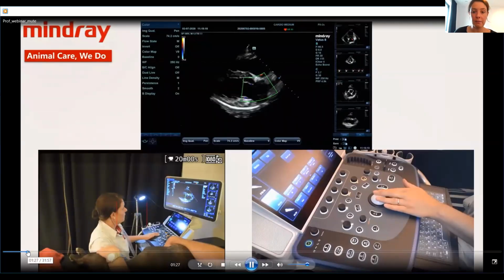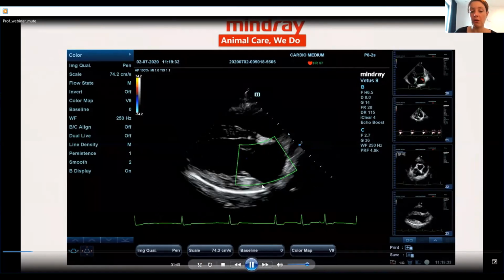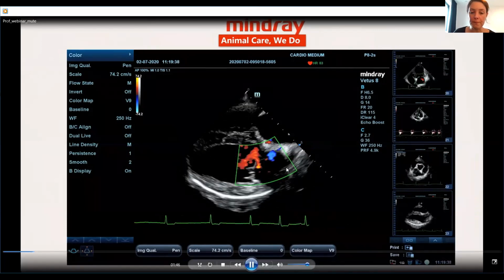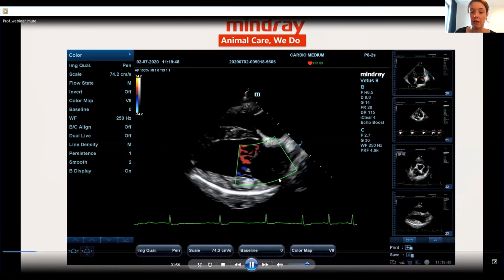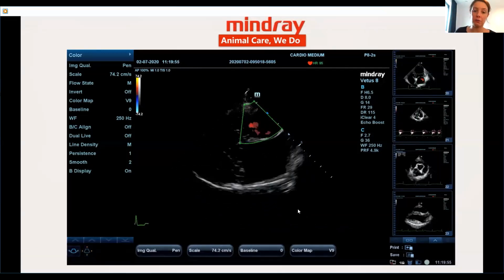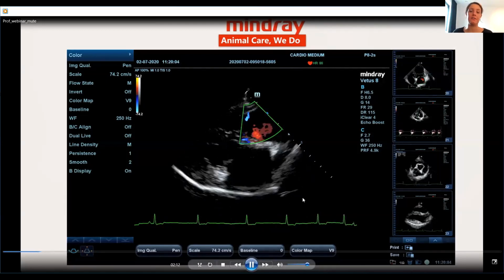Then what you can do in this image is assess the cardiac valves using color Doppler. I have to say, Doppler always works best when you are parallel to the blood flow, and this is less so for color Doppler than for pulse wave and continuous wave Doppler. You see, I am scanning from here, so I am perpendicular to the bloodstream, but it helps to also have a look at the valves from the left apical view, because sometimes there will be small insufficiencies that you don't see in this view, and then you can check again on the left apical view.